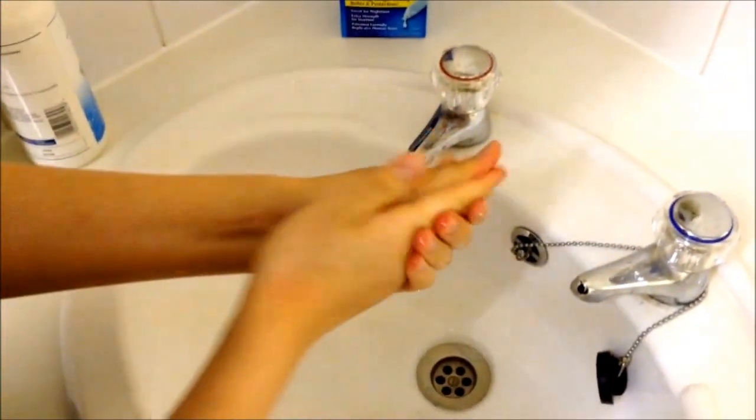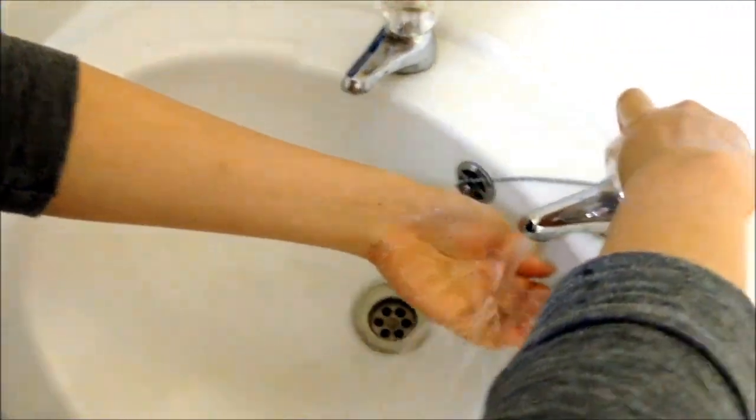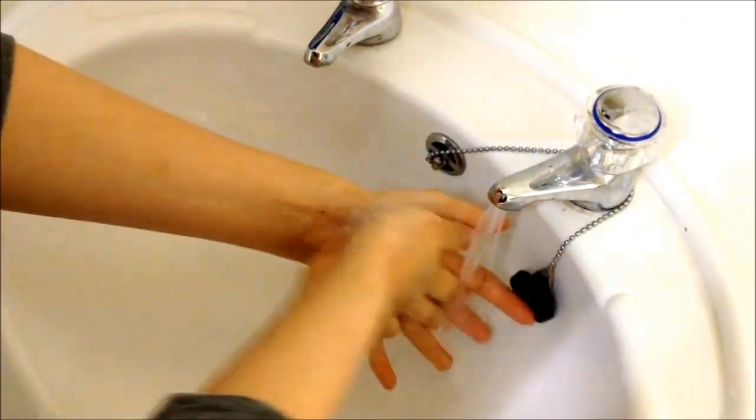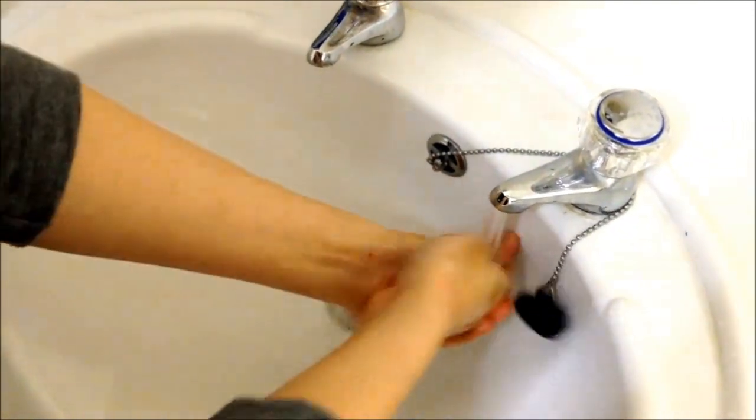Before touching your contact lenses, always wash your hands, ensuring that you rinse all the soap off and dry your hands on a lint-free towel. Do not apply make-up until after your lenses are inserted. Also, your fingernails should be kept short and smooth so that you don't nick the contact lens or scratch your eye.